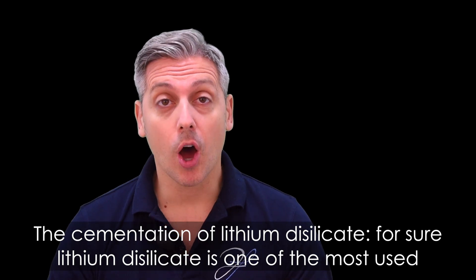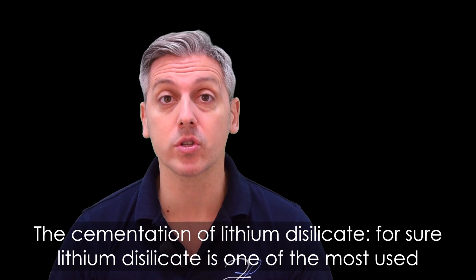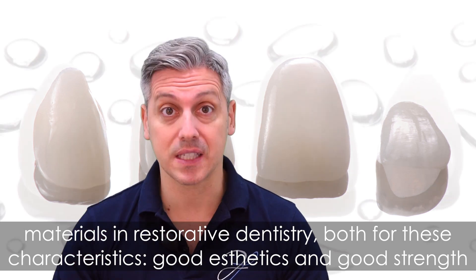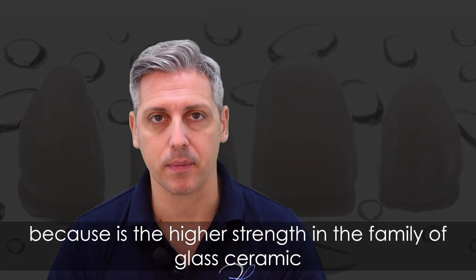This is the cementation of lithium disilicate. Lithium disilicate is one of the most used materials in restorative dentistry for its good aesthetics and good strength, because it has the highest strength in the family of glass ceramics.